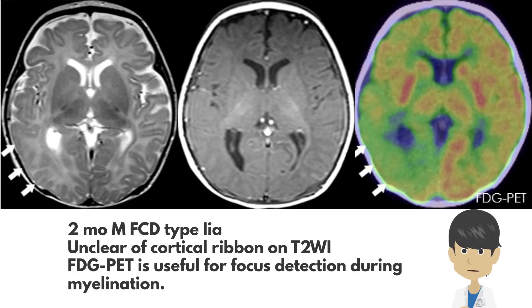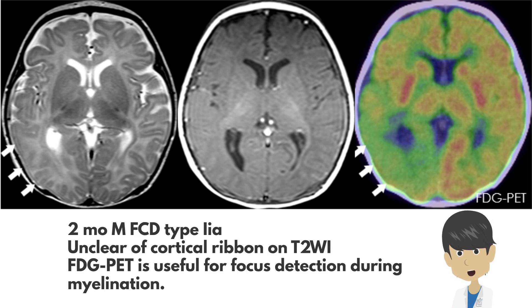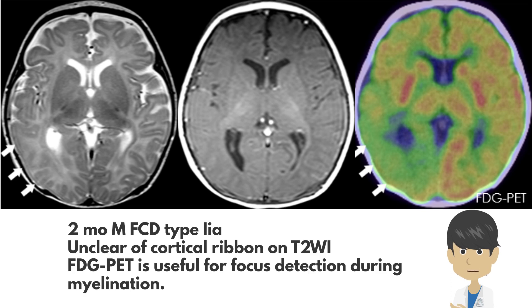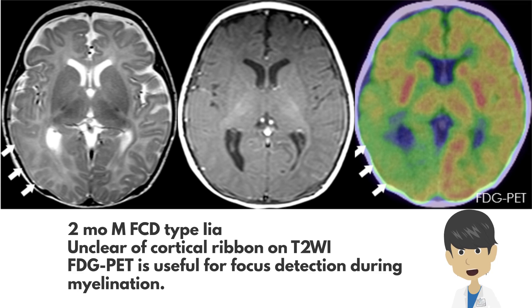A case of focal cortical dysplasia type 2a is shown. This is a two-month-old boy who is in the process of myelination in the brain. The T2-weighted image shows an indistinct appearance of the cortical ribbon from the right temporal lobe to the occipital lobe. FDG PET shows widespread hypometabolism in the same area.